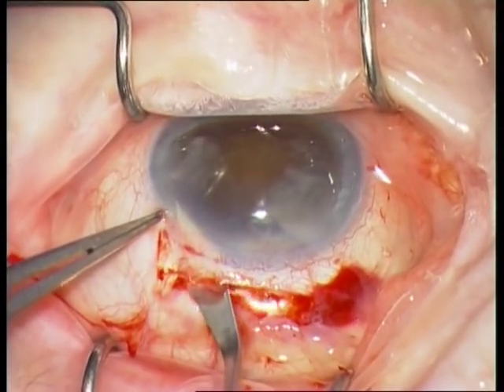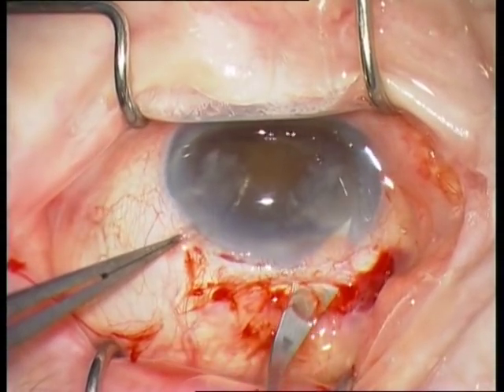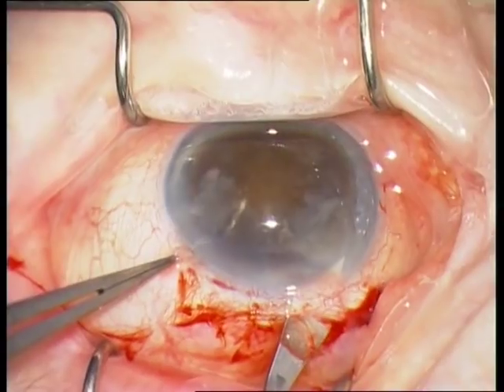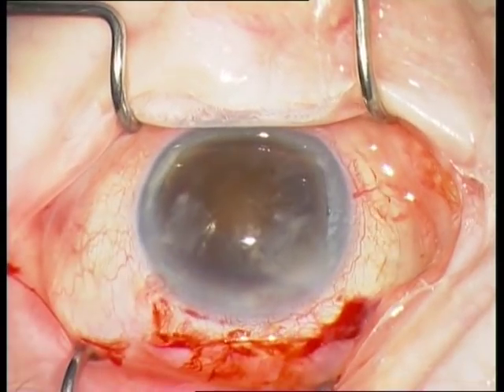The following step is the complete opening of the frown incision with the 2.4 mm blade. Remember to perform a V-shaped frown incision.